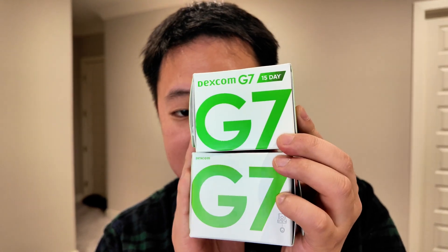The 15-day version of the Dexcom G7 is out now. I'm a diabetes doctor and I'm going to answer your questions about the 15-day product from easiest to hardest.